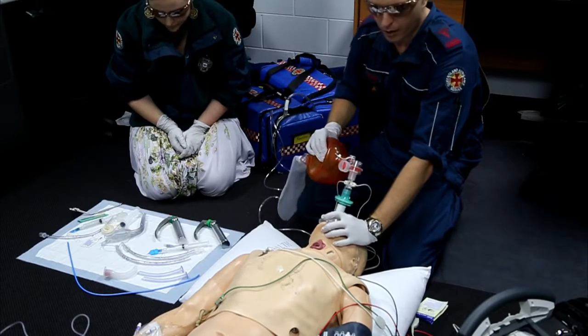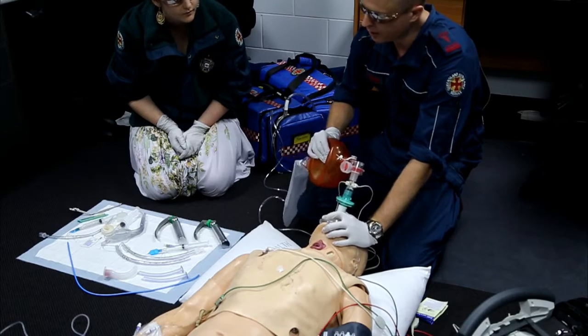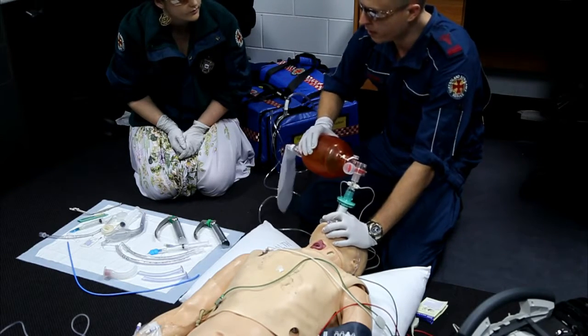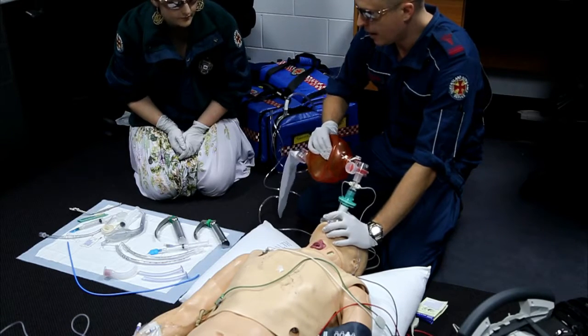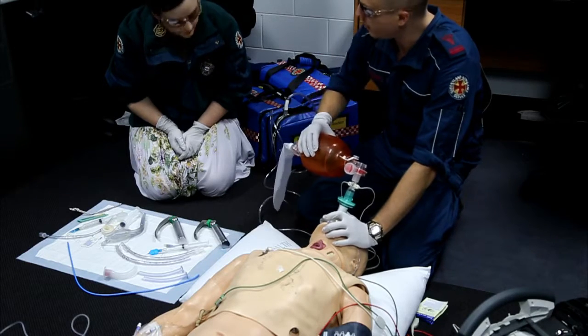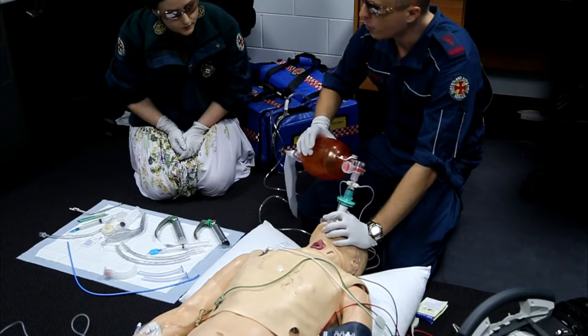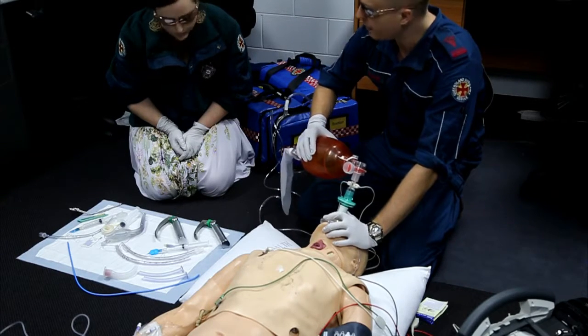Okay, we're happy with the setup. We're just providing some pre-oxygenation for the patient. So the plan as it stands is I'm going to make an attempt to intubate. If that fails, we're going to return to basic airway, Goodell, and either 1-person or 2-person bag valve mask operation. So if it's 2-person, I'll get you to squeeze the bag. We'll return him again to his pre-induction state, and then I'll make another attempt.